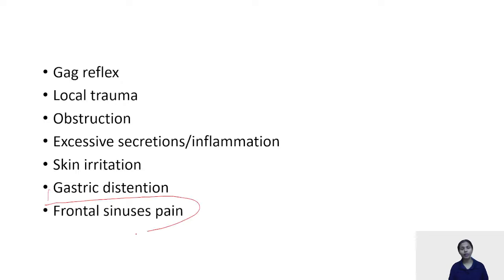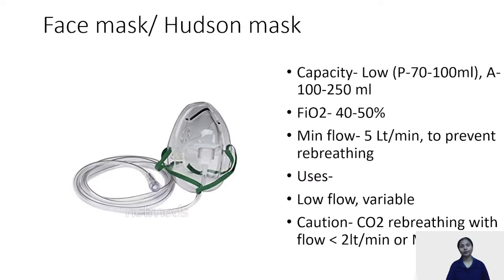One important thing that can come as a case-based question is frontal sinus pain. What generates the frontal sinus pain? It is generated because of the excessive flows that are generally given through your nasal catheter or nasal prongs, which can lead to pain in the frontal sinuses. Excessive flow rate from your nasal cannula, nasopharyngeal cannula, etc. can lead to frontal sinus pain.